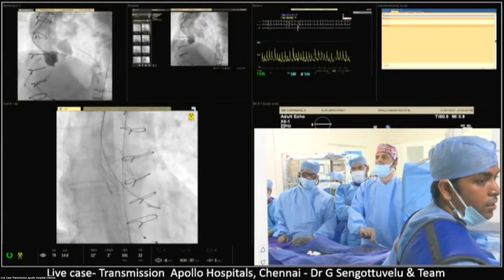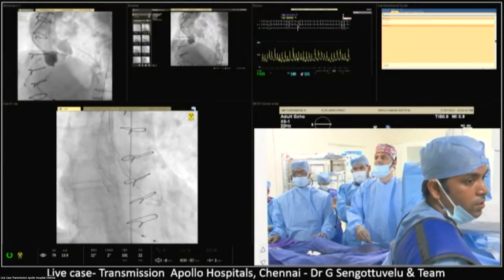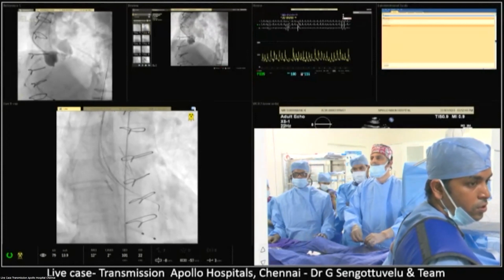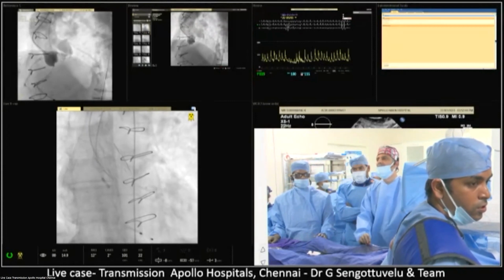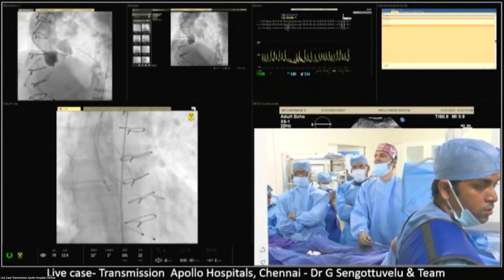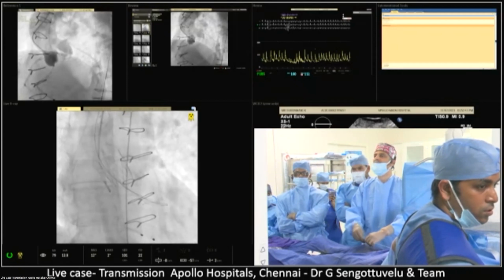I know, but not at this stage. This patient is in jeopardy. I understand the cost implications, but for this scenario, don't take chances, please. Yeah, I agree. Then we'll probably do the valve and show it to you a little later, because we might take some time to organize the balloon expandable valve. But Accurate Neo, we have right away.